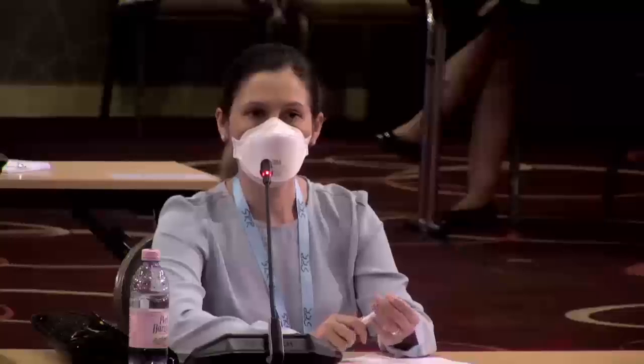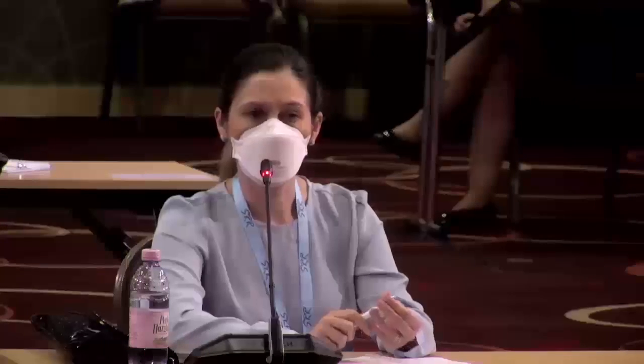Well, I think that CT is okay, but you're obviously missing the inflammation. Especially a low-dose CT does not have much more radiation, to be honest, than an X-ray. But I don't see why to do a CT when you miss a lot of inflammatory lesions, which are also diagnostically important. If you do not have an MRI, or it's not easily accessible, or the patient does not want to go into the closed machine, then a CT would be fine to check for sclerosis, to check for erosions, and so on. But MRI is much better.